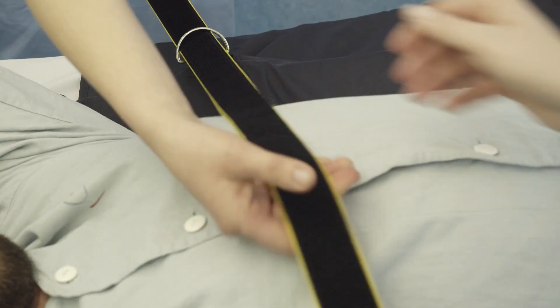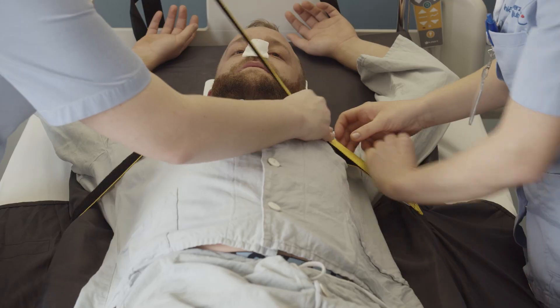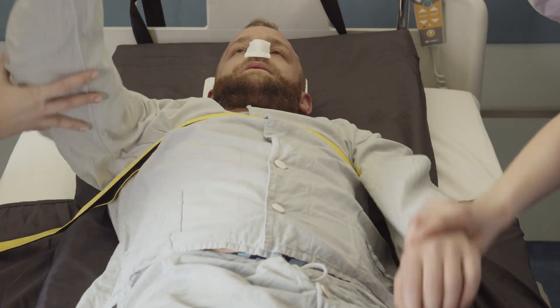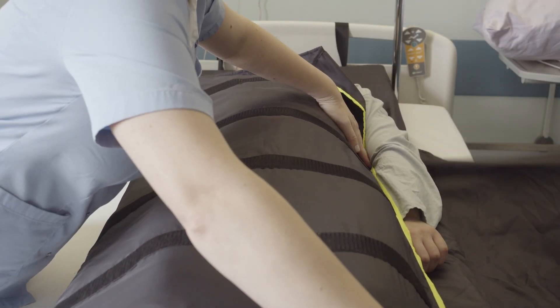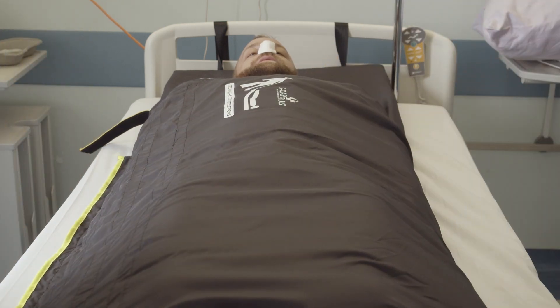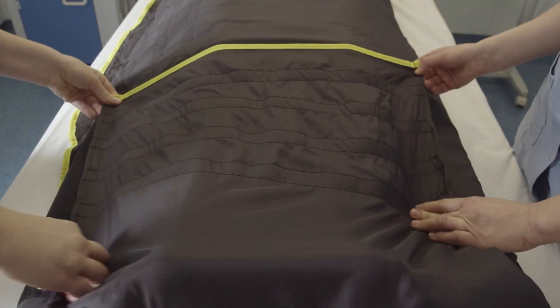Run the yellow belt over the patient's torso through the loop and tighten firmly the patient's torso to the evacuation mat. Arrange the arms alongside the body and above the waist. Pull the sides together. Arrange the hands alongside the body always under the sides of the mat. Attach the right side with the Velcro over the left side. Fix the sides as tight as possible. Close the sides as tight as possible at the feet area.